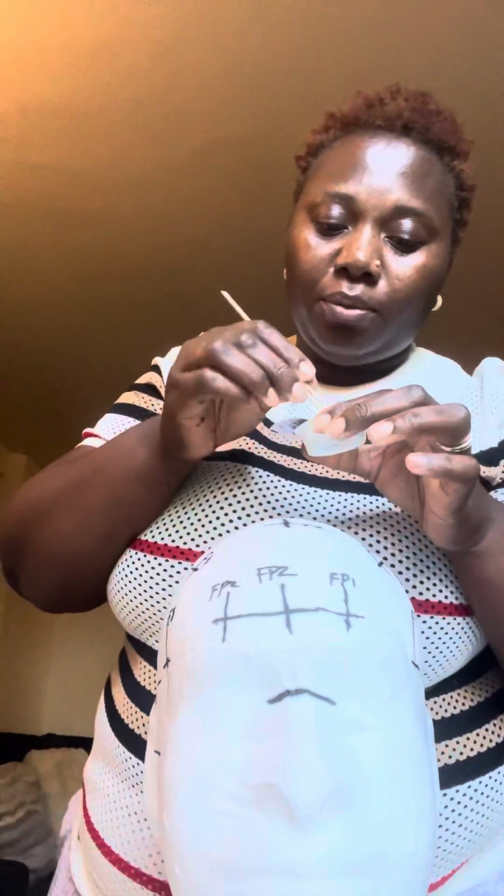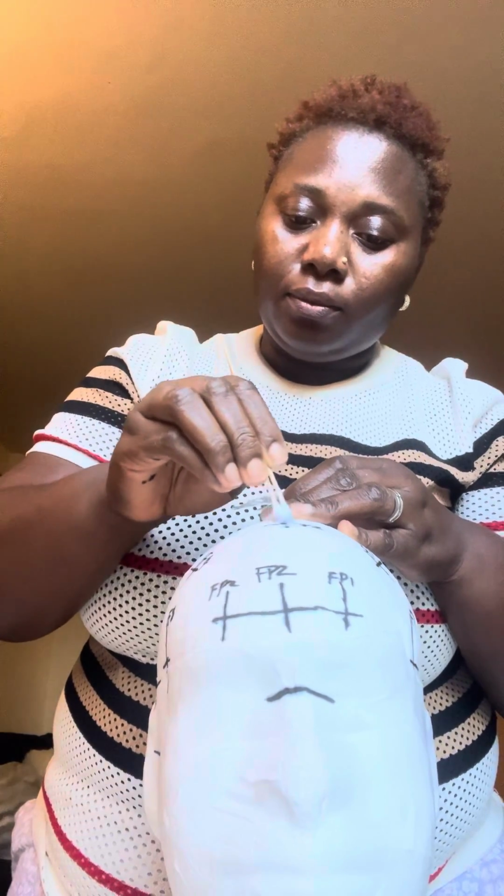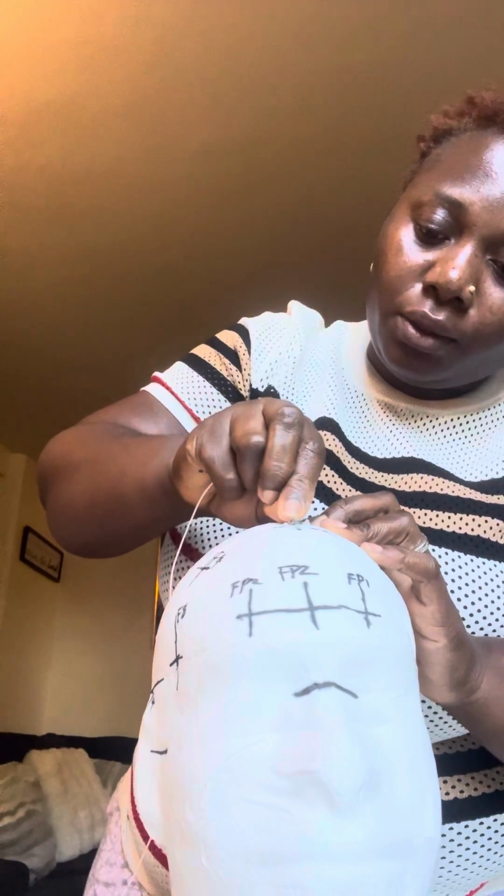I'm using white, one color. First and foremost, I'm going to prep the skin before I apply my electrode. I'll prep the skin very well. FZ. And I'll place my electrode, FZ.